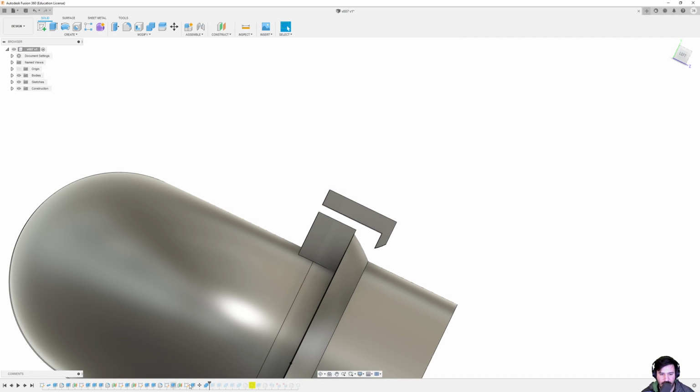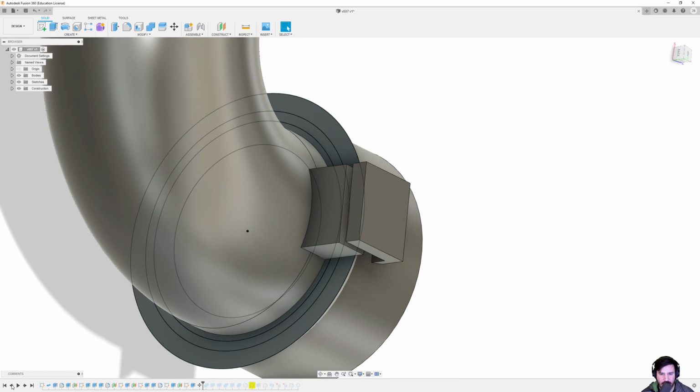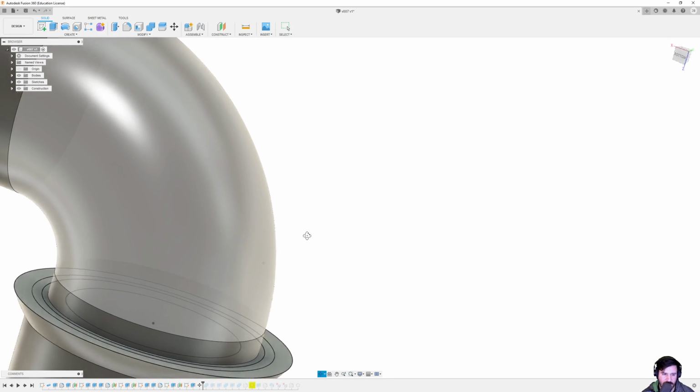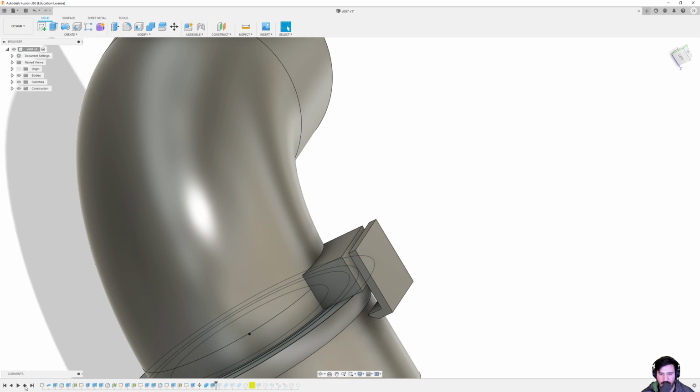And then from there we did, what is this? Oh, I combined some pieces. So there were two pieces that were not combined that I combined. For some reason I was getting some interesting little plates on here. Again, an artifact of the way I'm doing this. I didn't really do it quite right. So, that was just an artifact of that.